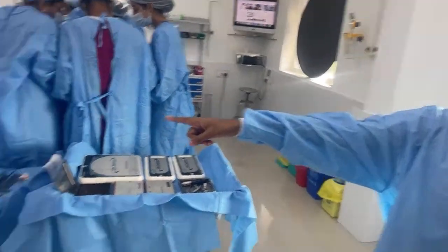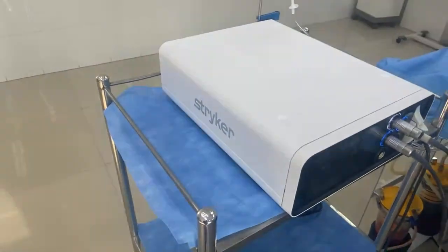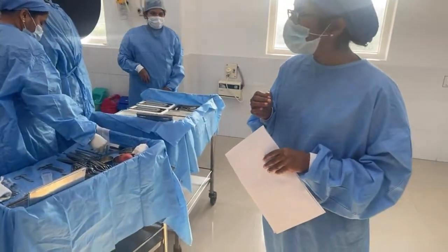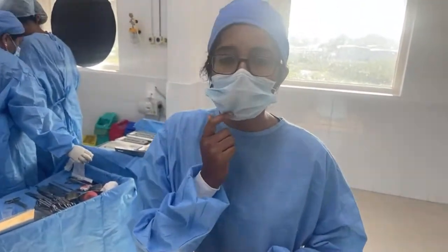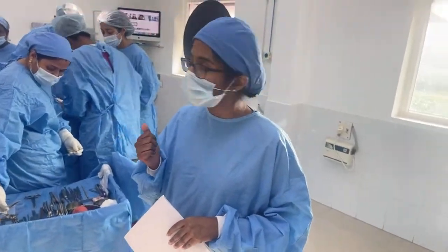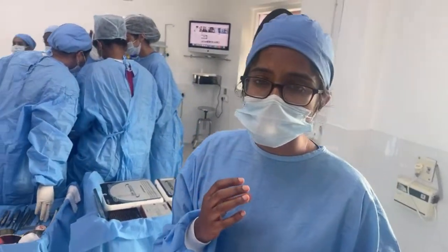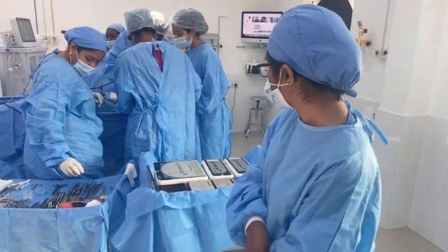Can you show us that? That is the sound which is rolling now. We've made markings on the chin, and right over the marking we are going to osteotomize the chin segment, which is happening right now as we speak. Once it is osteotomized, we are going to fix it with plates and screws in the desired position.